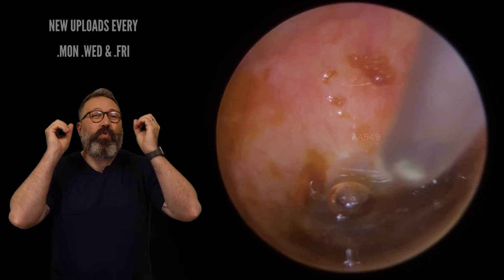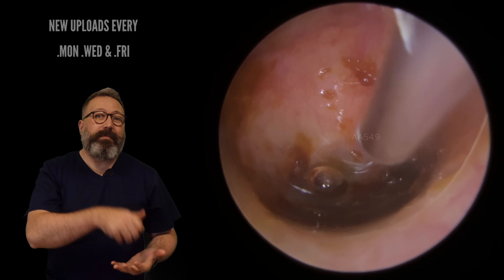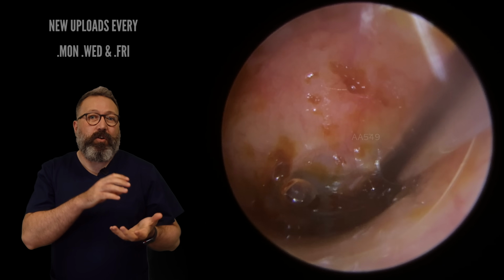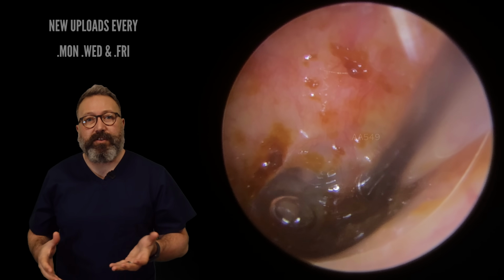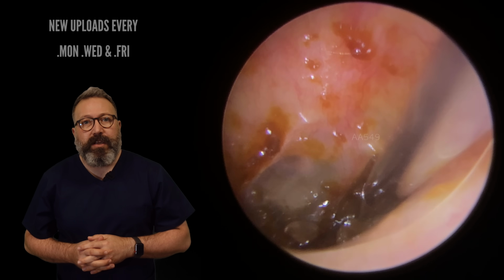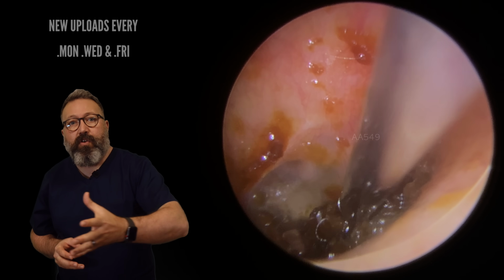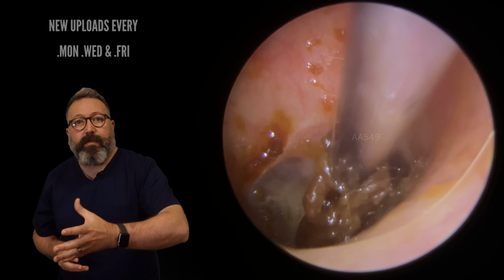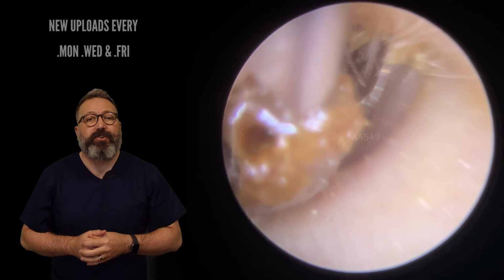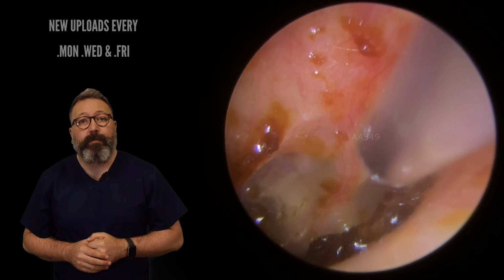So I've swamped this with olive oil. I've put loads and loads in here, because if I get a bit of movement next time, I'm hoping that with that oil in there as well, it's going to pull the whole thing. So we've got the fine end on here now as well. Let's aim for this big chunky bit here at the top and see if we can draw this across. There we go. That's a nice section. You can see how it just slid across the olive oil on the surface of the canal wall.